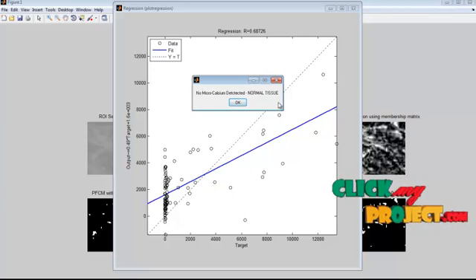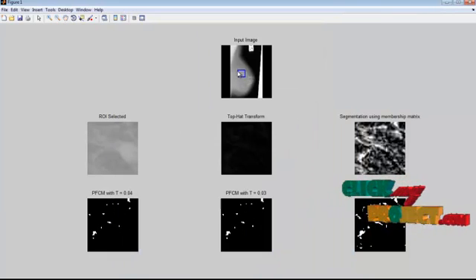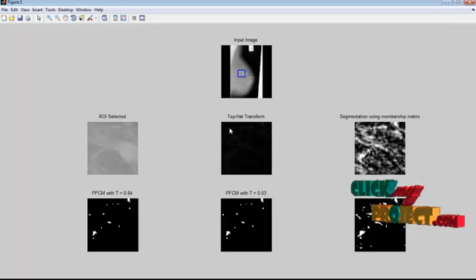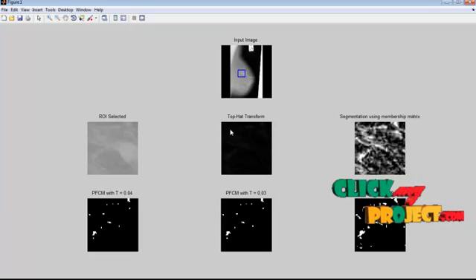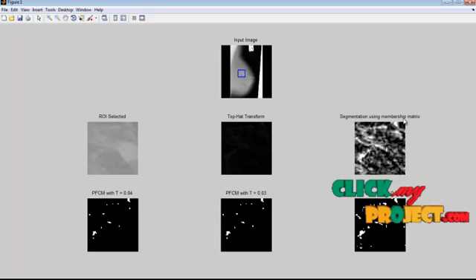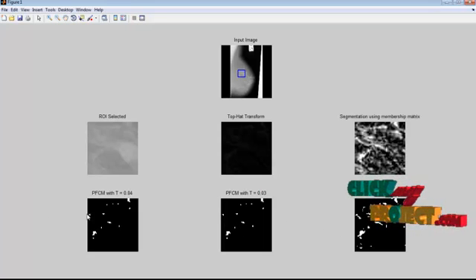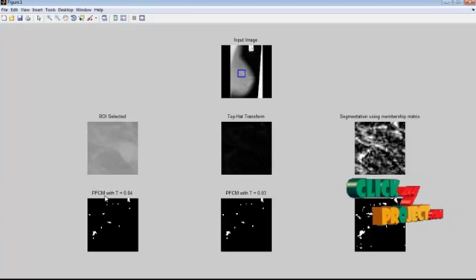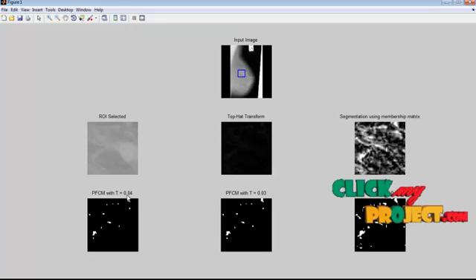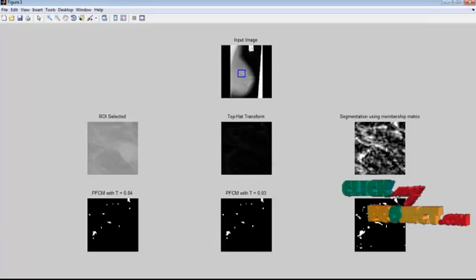In the selected region of interest, no micro calcium has been detected. The selected region is shown separately. This is the top hat transform applied for image enhancement. This is the segmentation result using the membership matrix, and these are the segmentation results using the PFCM clustering algorithm with different threshold values such as 0.04, 0.03, and 0.02.